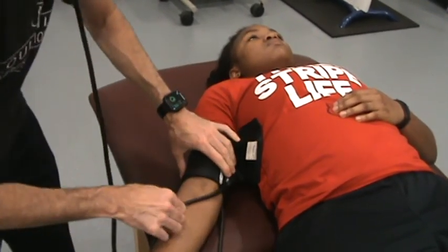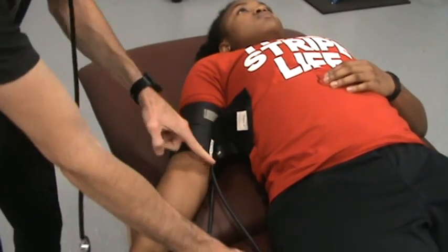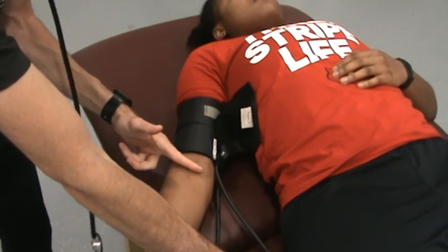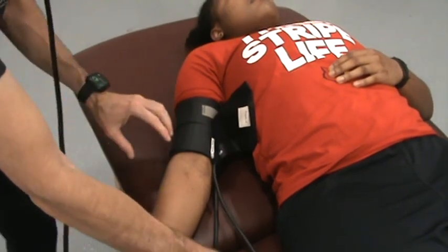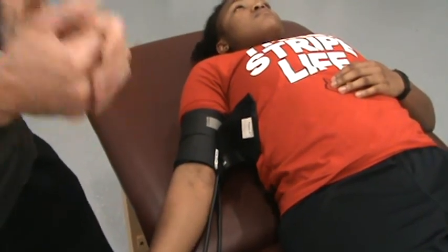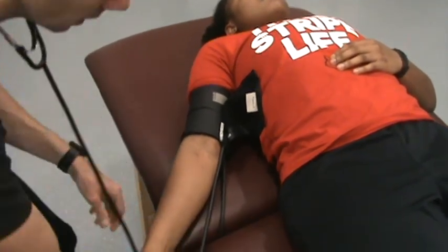Okay. Now notice that the cuff edge is 1 to 2 centimeters above the crease of her elbow. That's where we want that, okay? And again, this is the center of the cuff. We want the center of the cuff to be right over the artery, so when we pump it up, that artery is completely closed off, okay? So our cuff is in position.